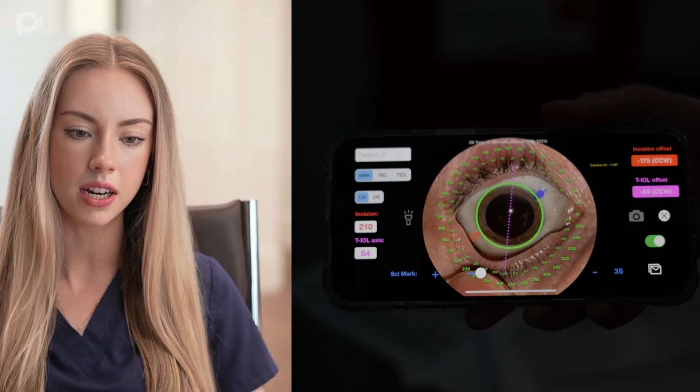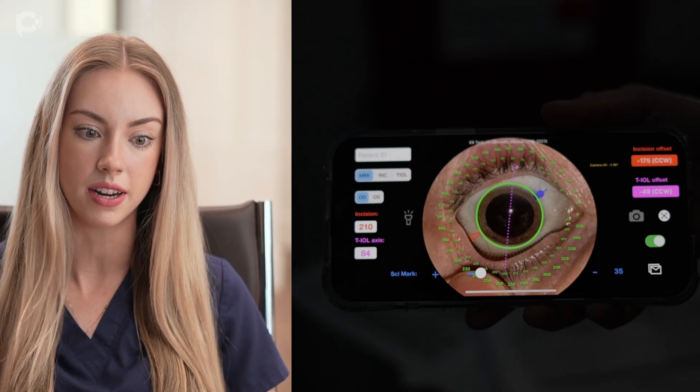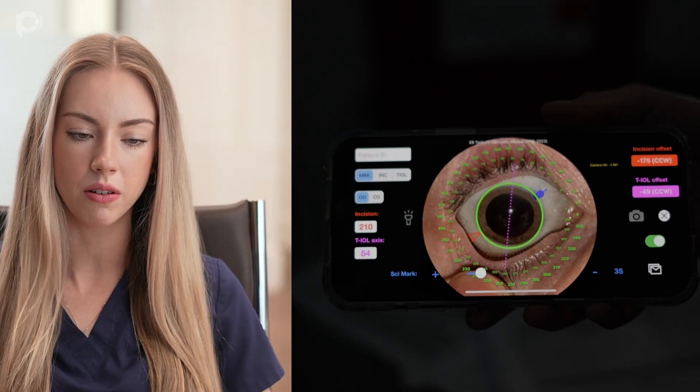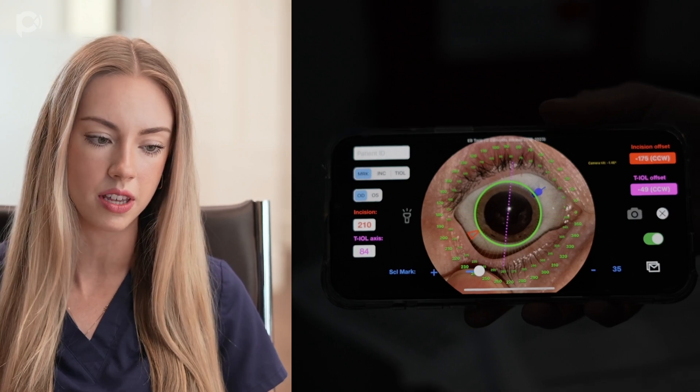Here we're getting the number minus 49 counterclockwise, so we're going to mark the eye at 49 degrees for this patient. If the number is positive, though, we subtract it from 180, and that resulting number is what we will use for the mark.